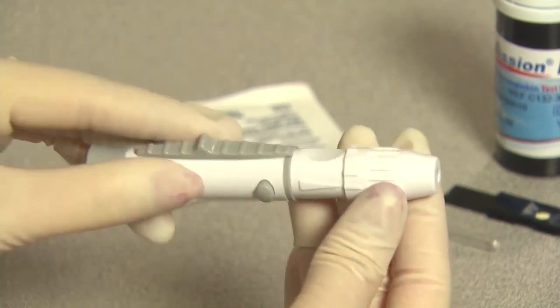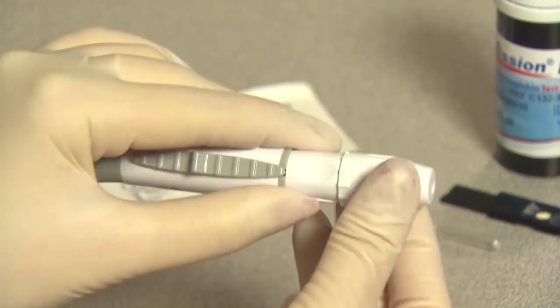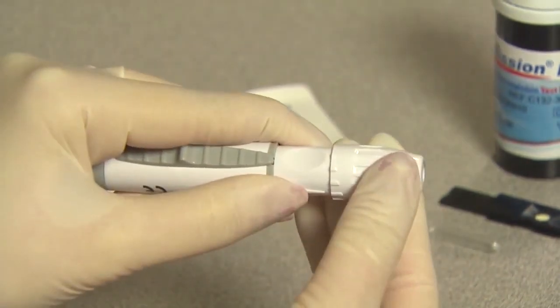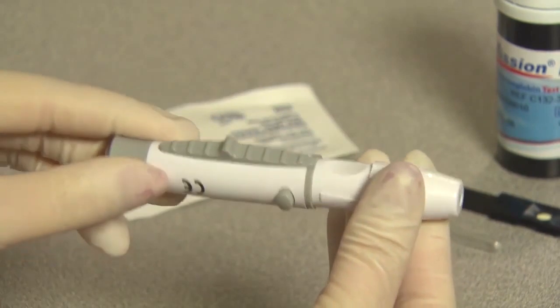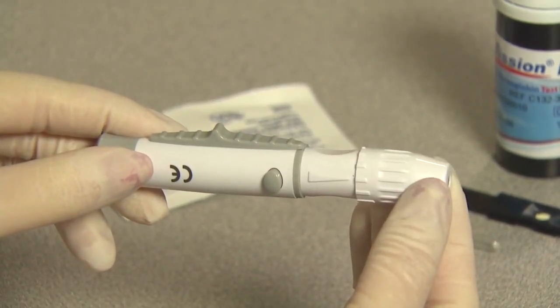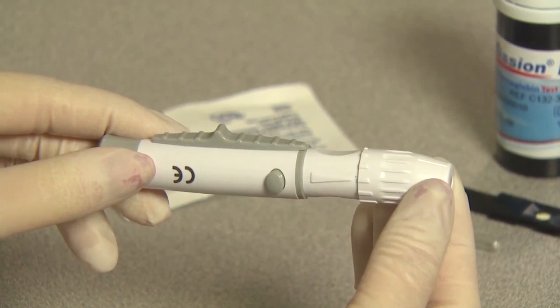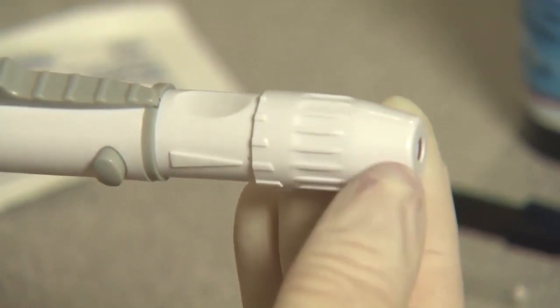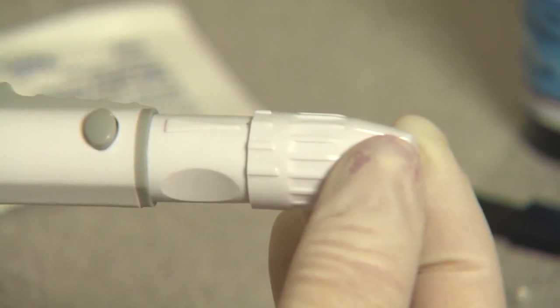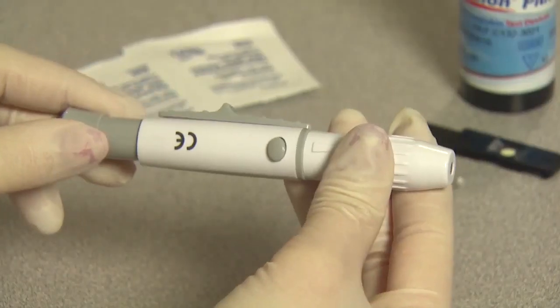Adjust the puncture depth by rotating the lancing device cover. There are a total of 6 puncture depth settings. To reduce discomfort, use the lowest setting that still produces an adequate drop of blood. Use settings 1 and 2 for delicate skin, 3 and 4 for normal skin, or 5 and 6 for calloused or thick skin. Pull the cocking barrel back to set the lancing device.